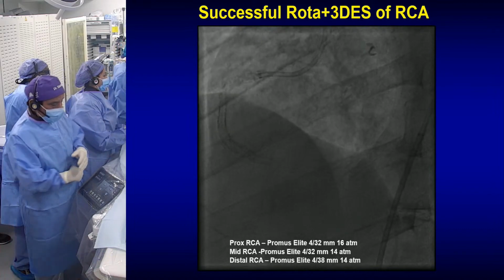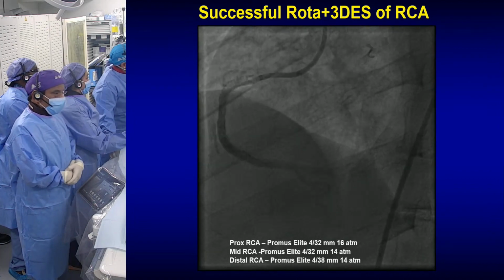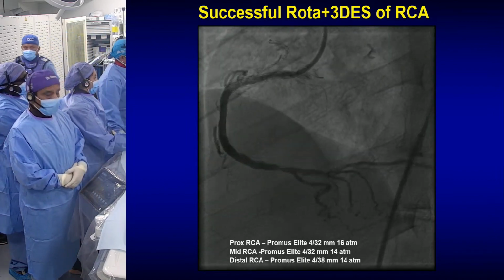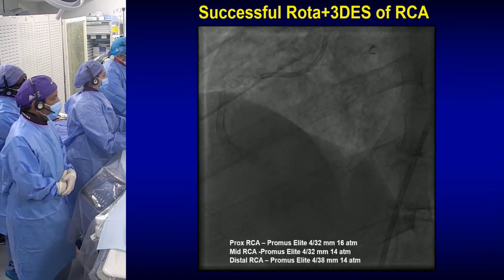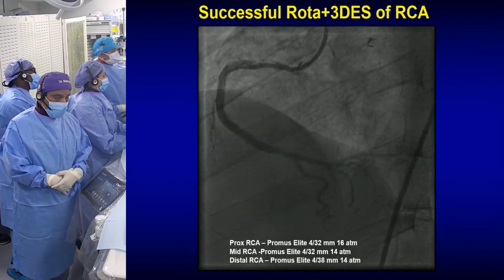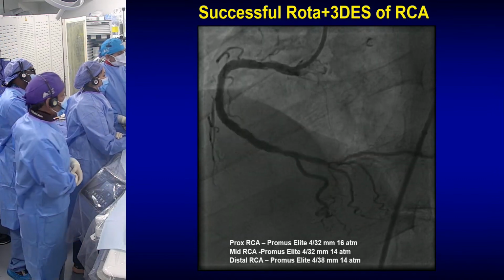So we are going to look into those data, and I assigned one of the fellows to look into it from our massive interventional database. We'll have about 300-400 patients before and 300-400 after the IVL, and we'll see the outcome, how they are in this current era. My feeling is that IVL is synergistic to rotational atherectomy. It really allows us to use a smaller burr, and in turn will lead to lower complications. But that's anecdotal till we have the solid data.